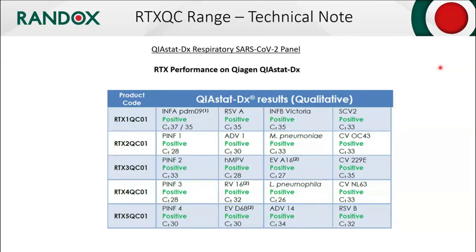Again, we can see that all of the analytes are returning a positive, and we've also got CT values that you would expect to get on that instrument that we can now provide as well.